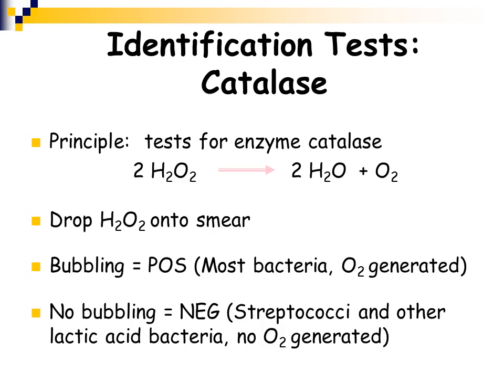So the key identification: you're in the clinical lab, you have a patient specimen, you gram stain it, and you see gram-positive cocci. You should immediately, in a clinical setting, be thinking Staphylococcus or Streptococcus. So your first step is going to be a Catalase test.